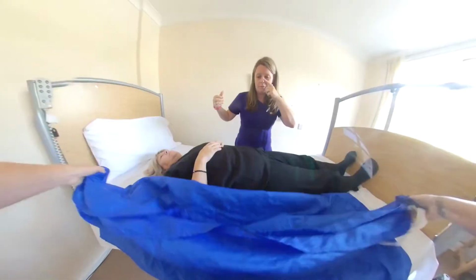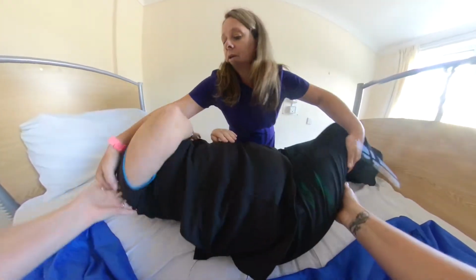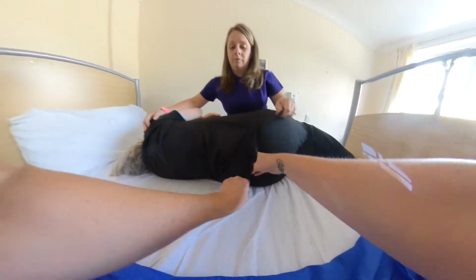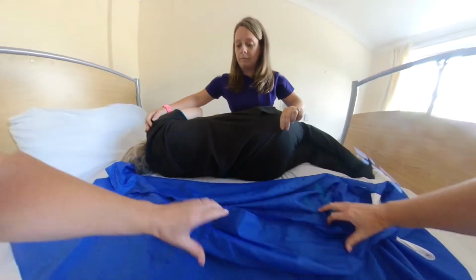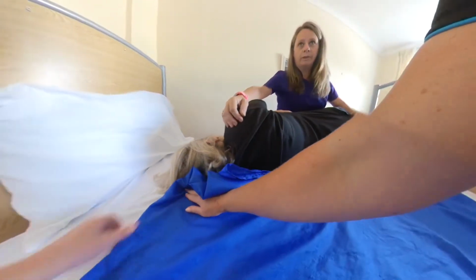To get the slide sheet into position, first you need to roll the service user onto their side. Push the slide sheet into place behind their back and then roll the service user onto their opposite side.